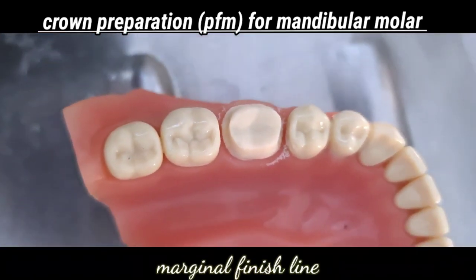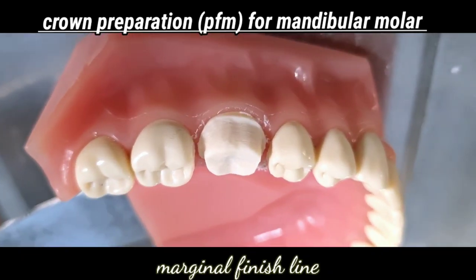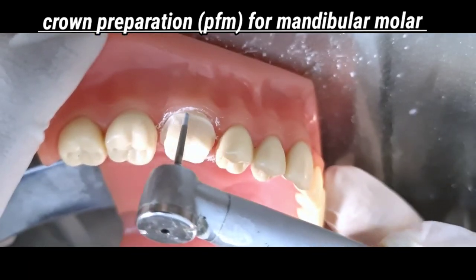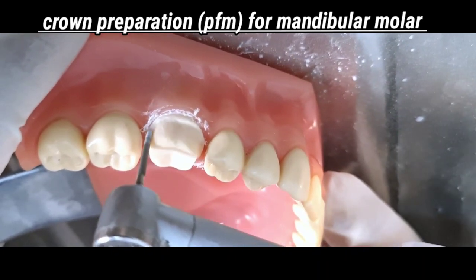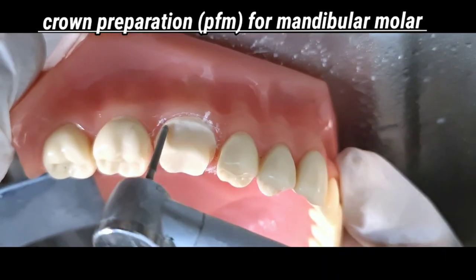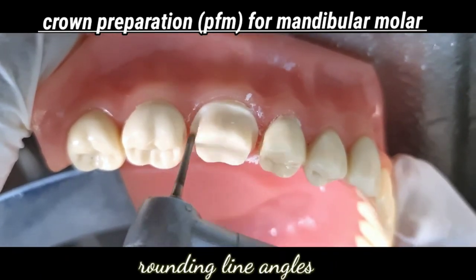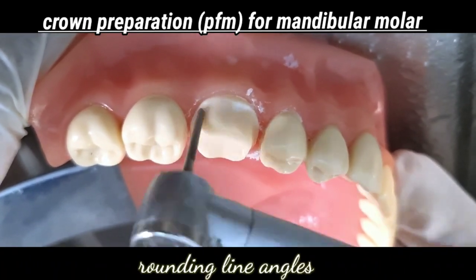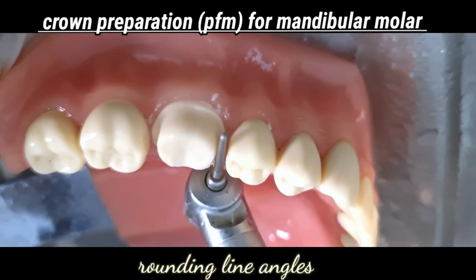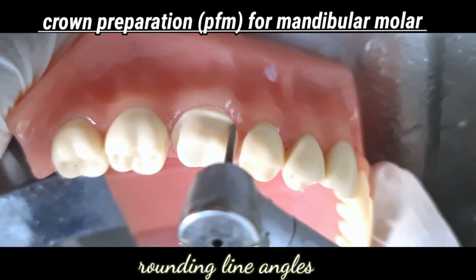The buccal cusp for mandibular molars and the palatal cusp for the maxillary molars are the functional cusps which withstand the occlusal forces. Therefore, they need to be reinforced with greater thickness, and to achieve this a functional cusp bevel is given in a preparation. You can give the bevel at a 45 degree angle, and the functional cusp bevel is given up to 2 millimeters for a PFM as well as for an all ceramic crown. However, there are considerable variations around these values. The functional cusp bevel helps in avoiding creation of occlusal interferences in excursion movements and to avoid any porcelain fracture. So the functional cusp bevel in itself helps accomplish the buccal reduction in two planes.